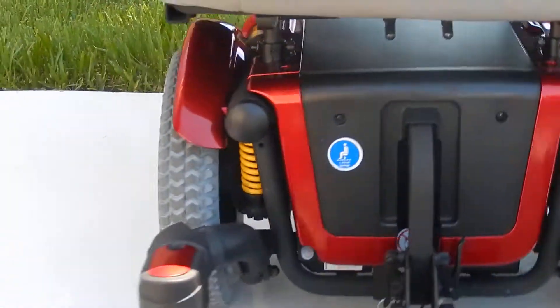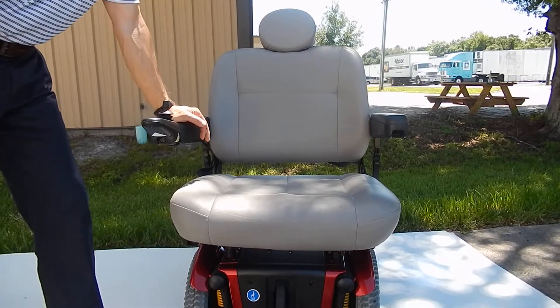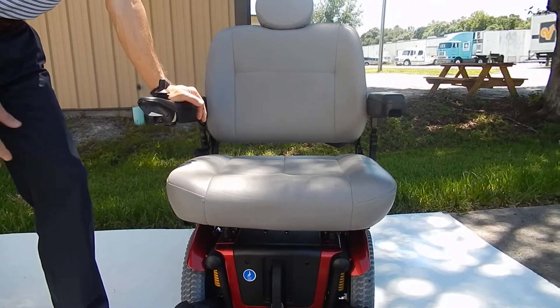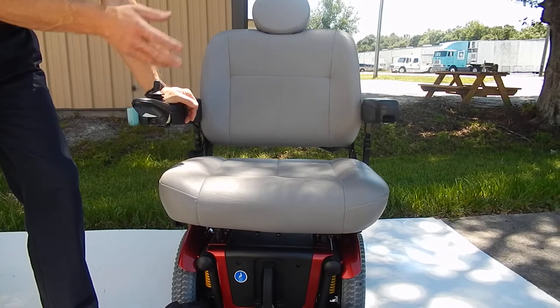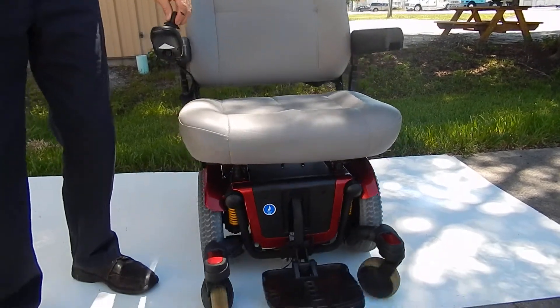The seat on this chair is an extra large seat. It's a 26-inch seat by 21-inch deep. The seat can be changed — we can accommodate anybody's size. We can put a smaller seat or a larger seat on this chair if need be.